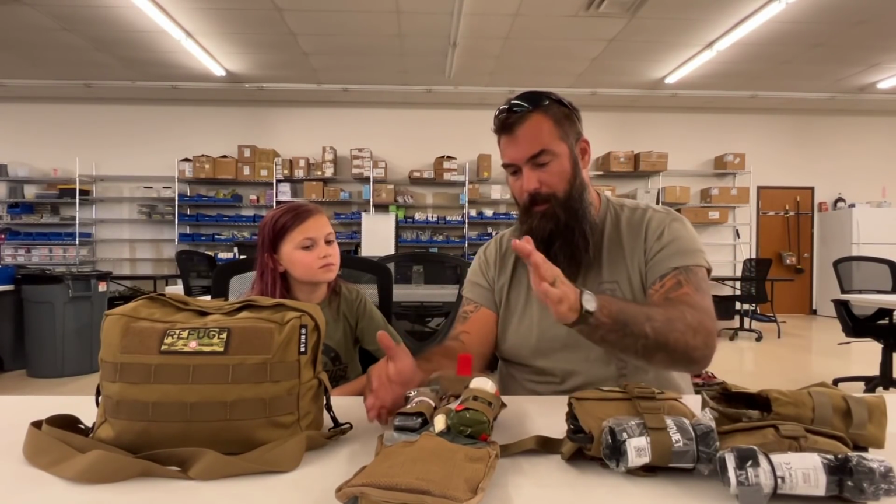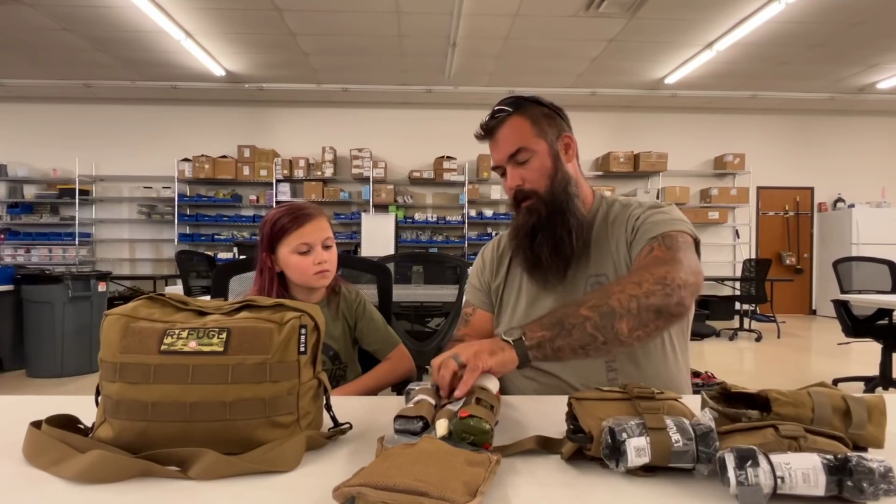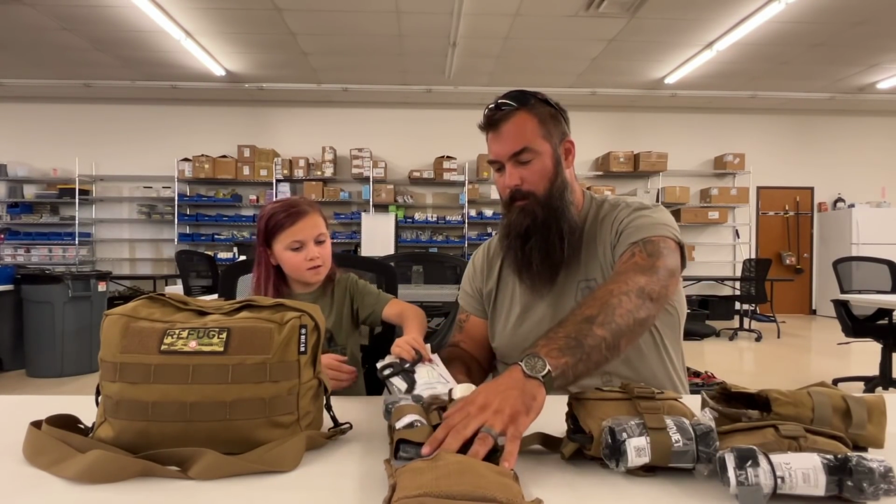And so you got your tourniquet and your pressure bandage here, gloves and blah, blah, blah. This is our massive bleeding stuff. Go ahead and pull that out. Like all of it? Yeah, good. That's called the stack. Nice.